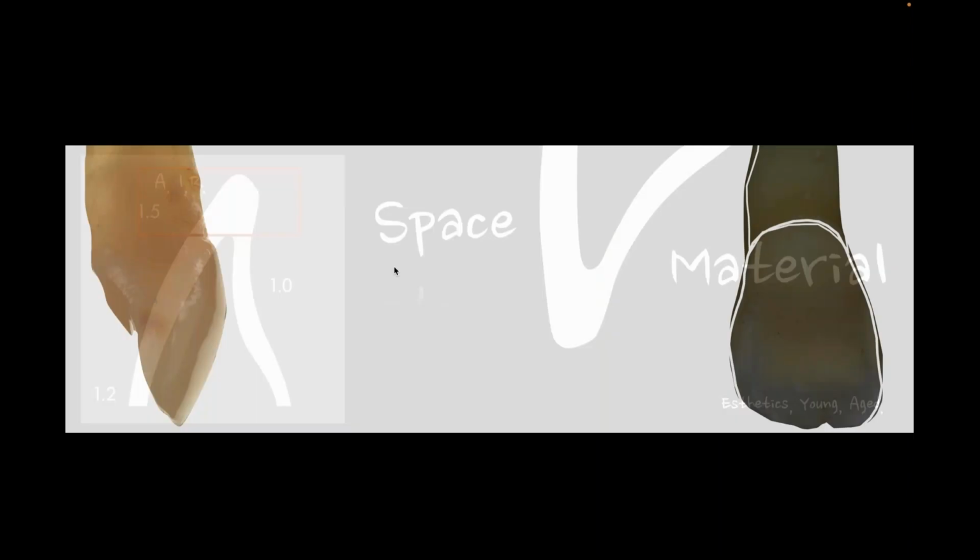The other aspect of the incisal edge is managing the air. So in a veneer case, we're utilizing the tooth a lot of times to help us with the support and the light optics. When we're not doing that in full coverage restorations, we're managing what I call the air, the AIR. And that means that there's nothing there, and the light interaction between where your coping ends and where the light is going to pass is much more challenging for you to manage. And in order for you to do that, you're really going to have to manage that space with different materials, like opacious dentin materials, effect chroma materials, even sometimes fluorescent materials, because those are the areas where you're always going to have a more difficult time watching the light management pass through.